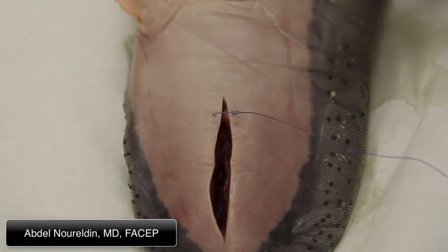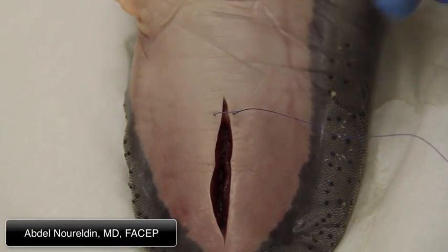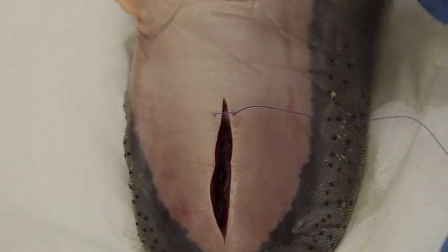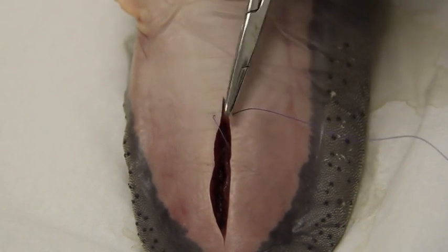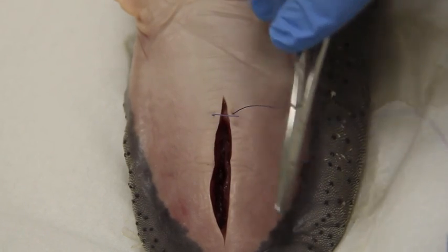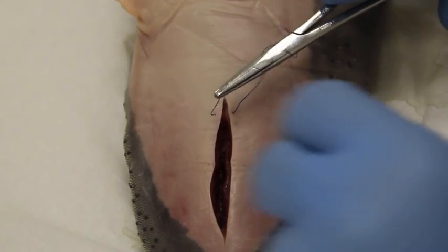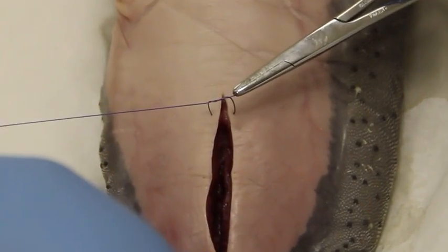Now we're going to do a square knot using an instrument tie. Take your driver or your needle holder, put it between the two threads, wrap it the first time twice, grab the tip, then pull and make sure it comes down flat.